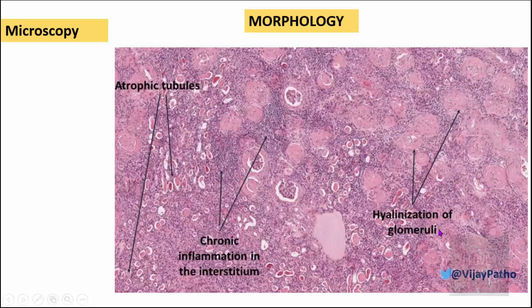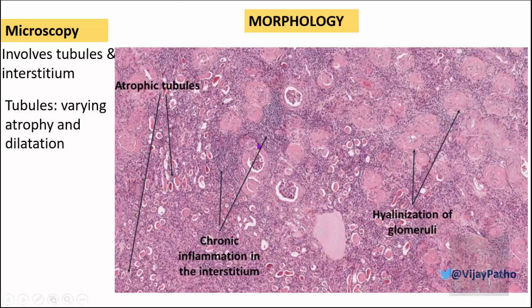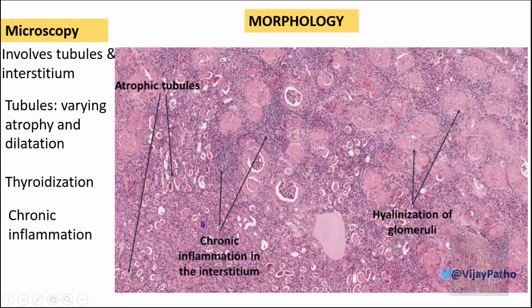Microscopically, chronic pyelonephritis is a disease of the tubules and interstitium, so you should look into the pathology of those structures. First, identify that you are dealing with renal parenchyma by locating the glomeruli. The tubules are of varying sizes, often showing atrophy — some dilated, some atrophied. A key characteristic feature is that these tubules are filled with eosinophilic material, resembling the structure of thyroid tissue, which is why this is referred to as thyroidization.